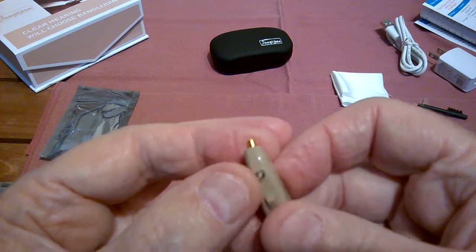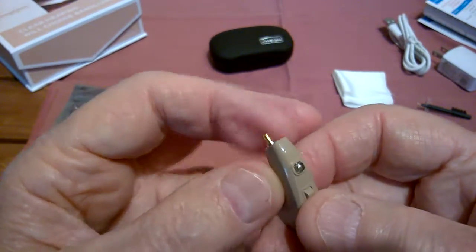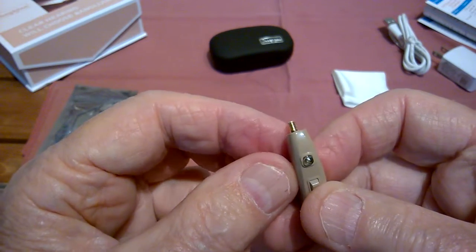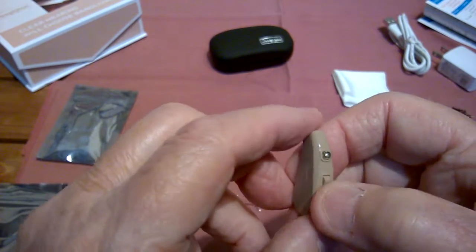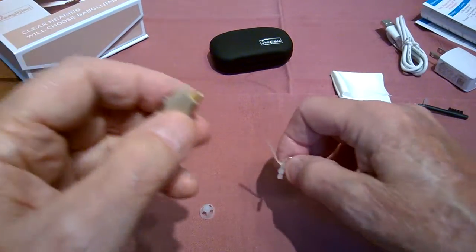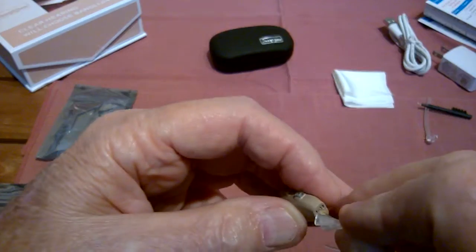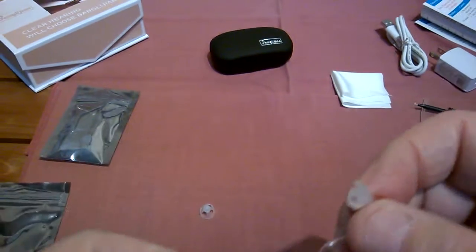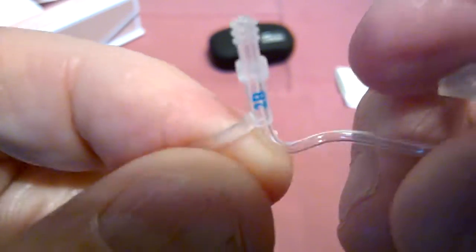And this also changes programs. There's 2 preset programs on this one. One is for normal, one is to get rid of some of the background noise. If you're in a restaurant or something like that, you will go to number 2. But up and down, volume up and volume down, very, very intuitive, this whole thing. The way these work, they have all the selections. This is the left, yeah, I think, yeah. It doesn't matter. The left one has really got a little blue mark on it, so you don't get confused. If you can focus on that or not. There you go. And the right one has a red color there.